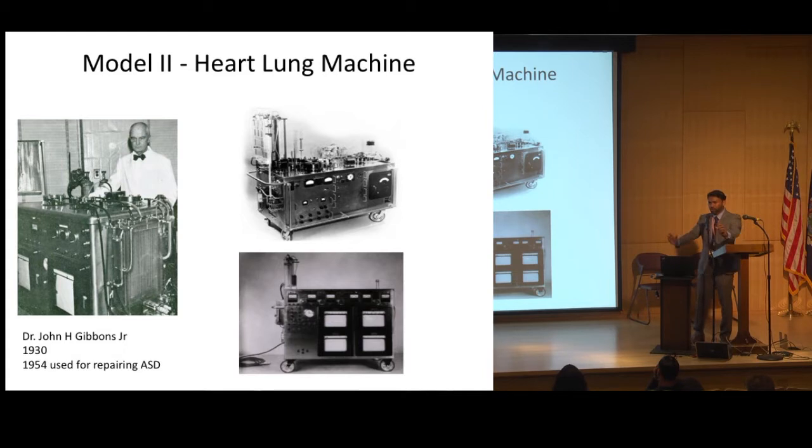And a lot of the time we know, whether it's ECMO, nitric oxide, oscillator, or proning patients, all that is an adjunct therapy, correct? Even if you talk about ventilation, it's something that you're doing to buy time. That's all it is. Whatever the underlying issue is needs to be worked on either way. So the underlying issue needs to be resolved or should be resolving for you to see a successful outcome. So everything that you do outside is just buying time.